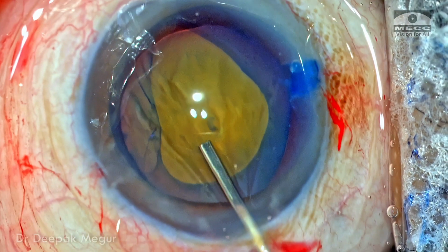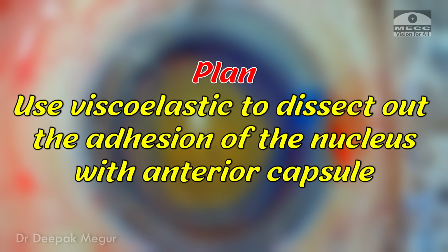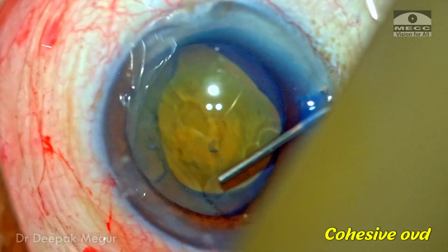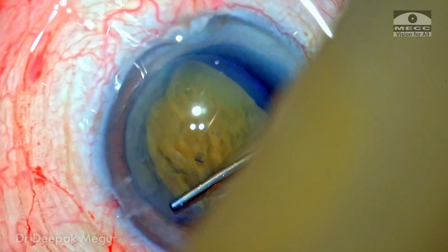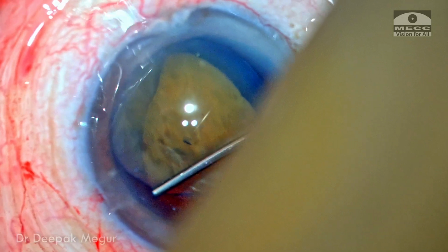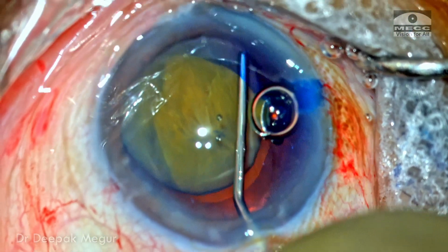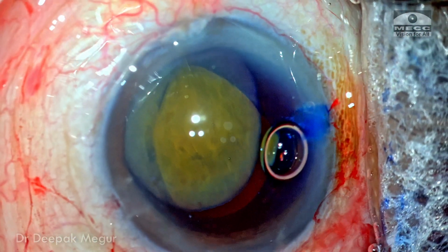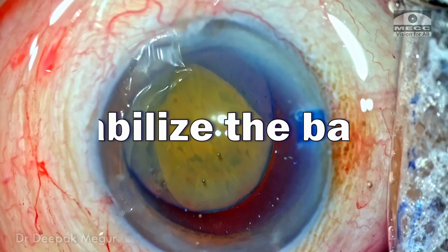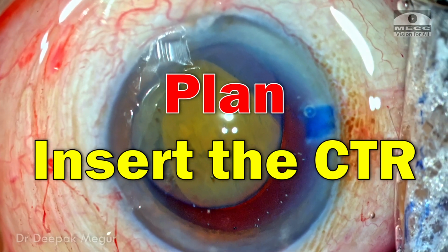So this was a tricky situation. I come back, and what do I do now? So I thought I could use viscoelastic to dissect out the anterior capsule from the underlying nucleus in a more controlled manner. I'm consciously using cohesive OVD, that is sodium hyaluronate. It's a space-forming agent. I'm going to inject it in the area where the capsule is not attached first, and then later in an area where it is a little bit attached. The cohesive OVD goes around the nucleus and it detaches it from its attachment to the capsule. So now the nucleus is free from its attachment to the anterior capsule, and this was a small trick which helped. The next job is to stabilize the bag. So the plan is to introduce the CTR now itself because I don't want to postpone it.